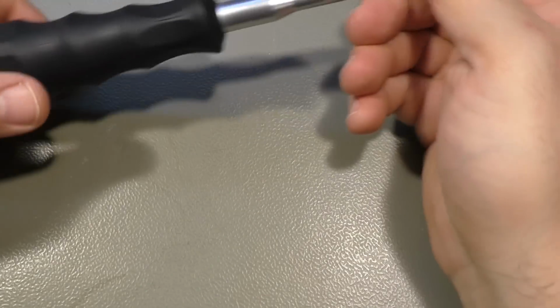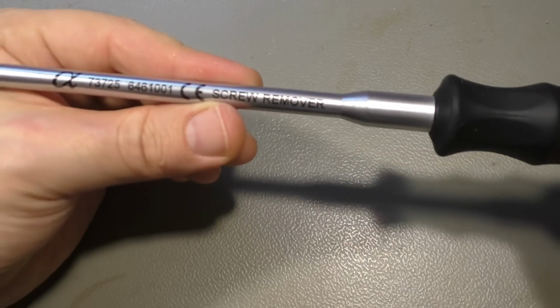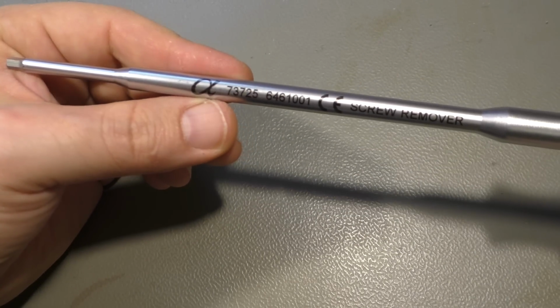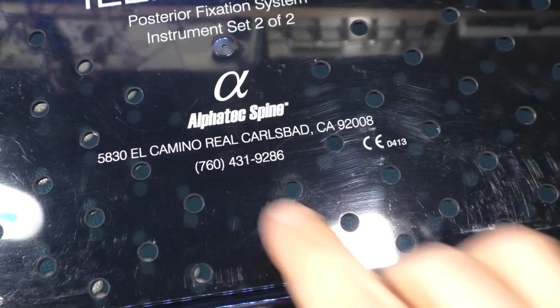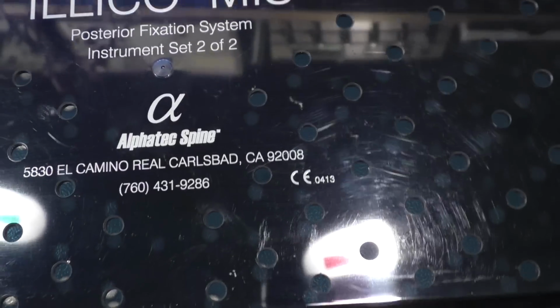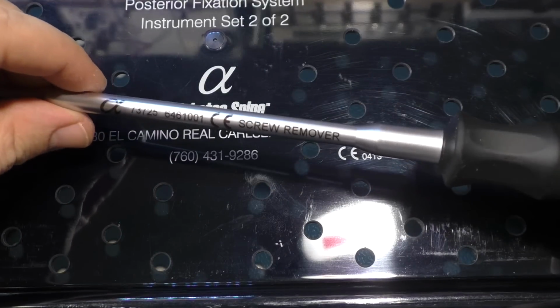And the second drawer has this tool, which is a screw remover. There is also a part number. By the way, the company here is Alphatec. Is that true? Let me see. Yeah, that's the company name, Alphatec Spine. Seems they only make tools for spine bone repair or spine bone fixation or whatever, a hex screwdriver.